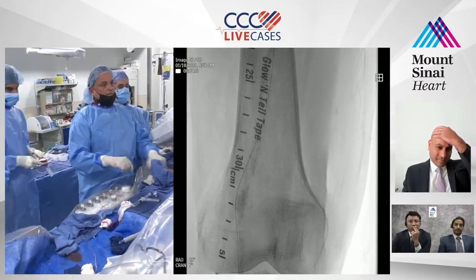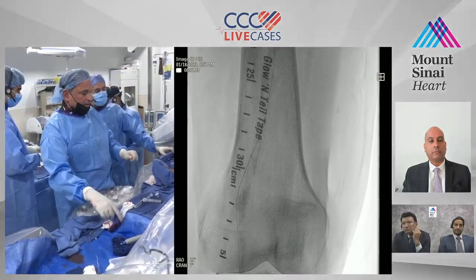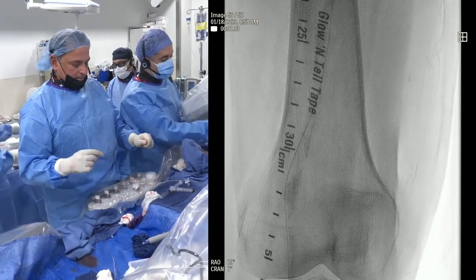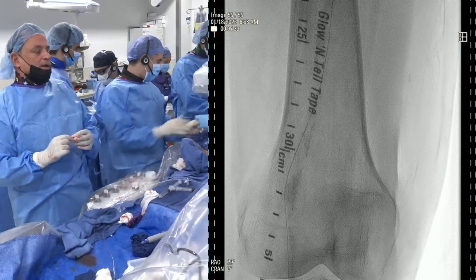Yeah. All right, let's get the antegrade. Ajit, you want to do that, brother? Yeah, sure. The antegrade stick. I'm going to continue to work from here. Okay. Give me a 018. I'll help Ajit set up. Yep, you set up Ajit. Ray, come on this side. Give me an 018. PK?